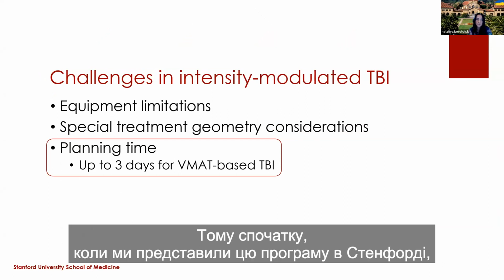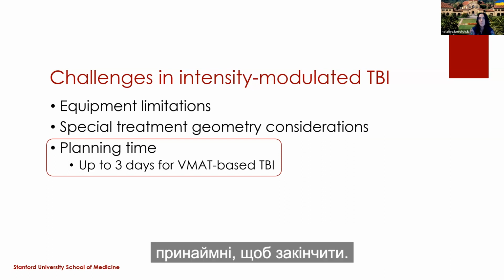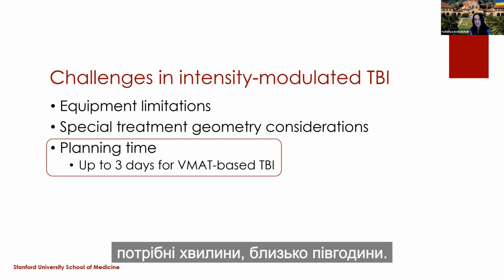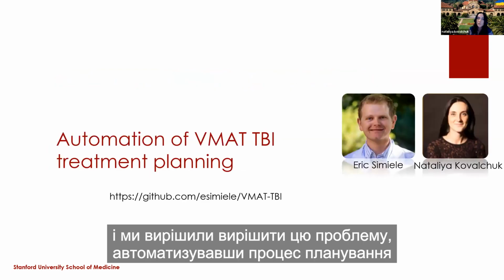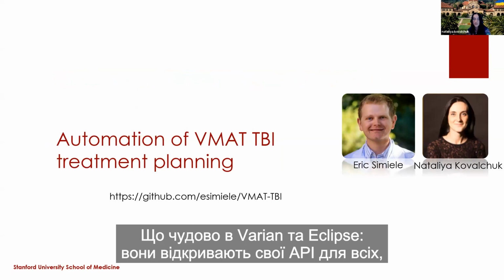So initially, when we introduced this program at Stanford, I was doing all the planning and I was doing it manually. It would take me a few days at least to finish up. So even to start the optimization, it takes minutes, the order of half an hour, because of the large data sets. So obviously we needed to improve, and we decided to tackle this problem with automating the treatment planning process using Eclipse API framework.